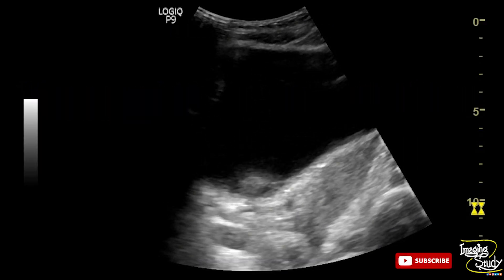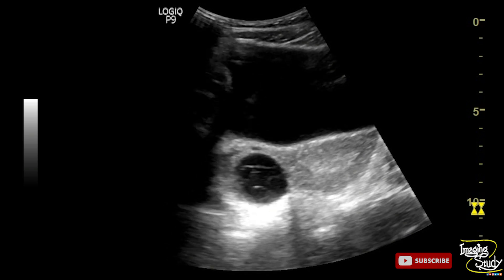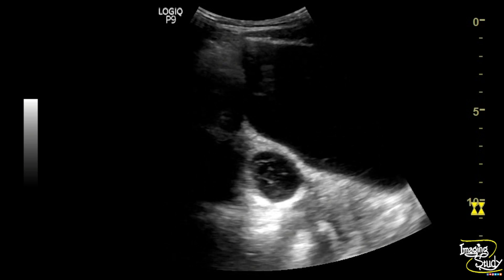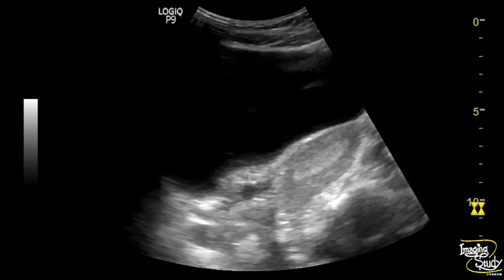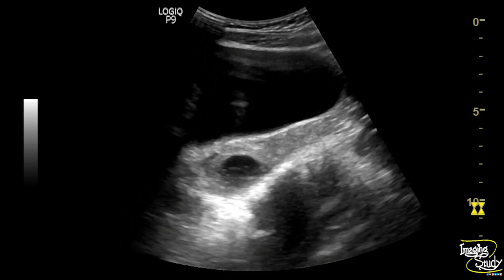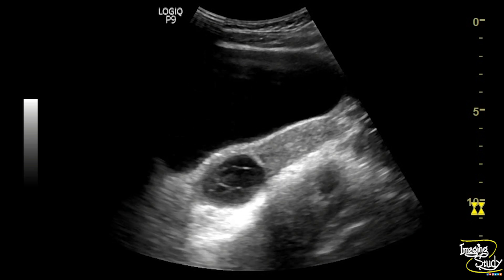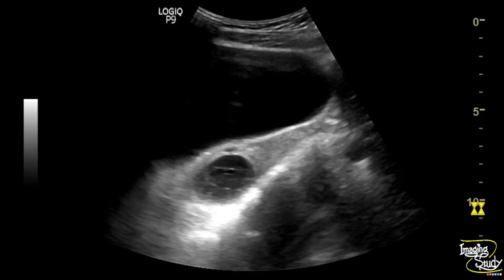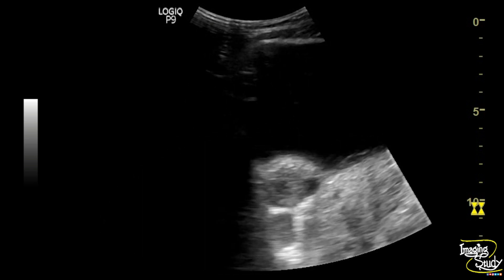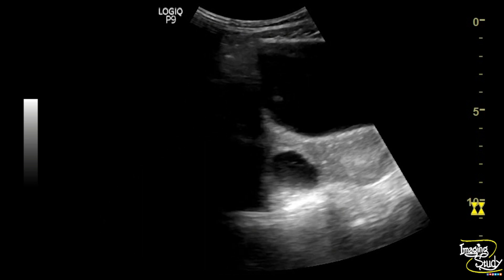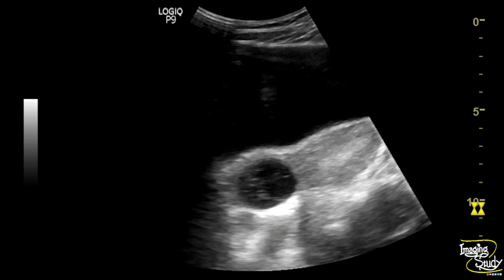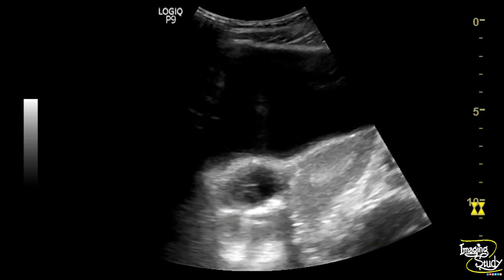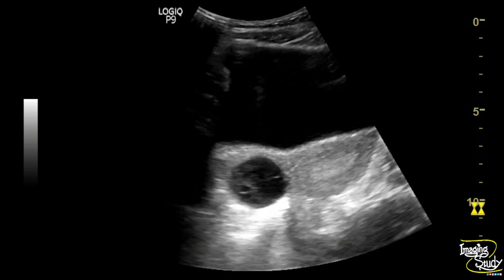On ultrasound, you can see a well-defined oval complex cystic structure with internal reticular pattern noted at the right adnexal region. The right ovary could not be separately visualized. This is a case of hemorrhagic cyst. The uterus looks normal from this section.